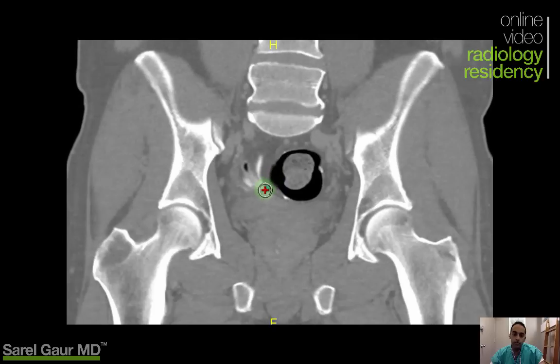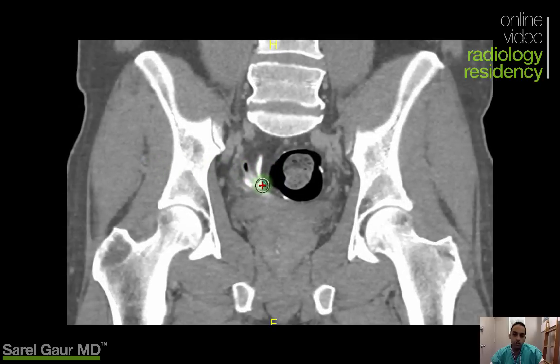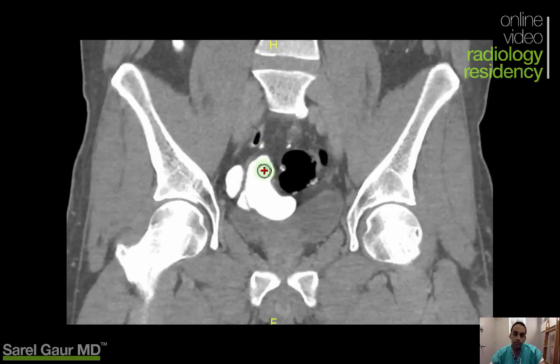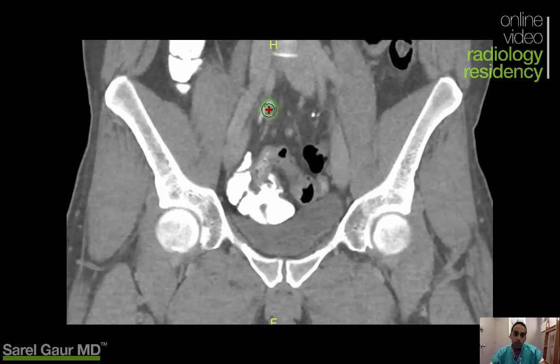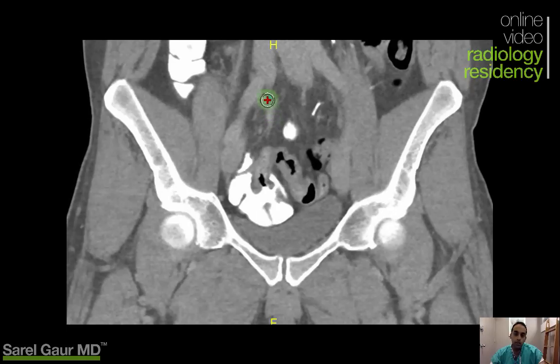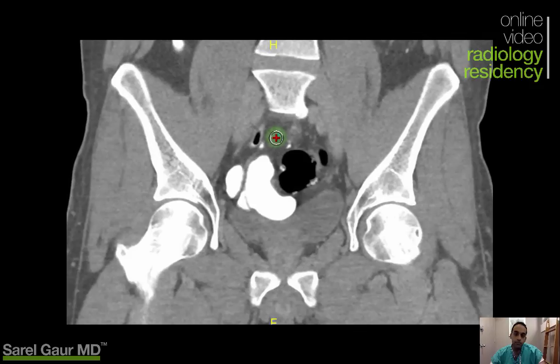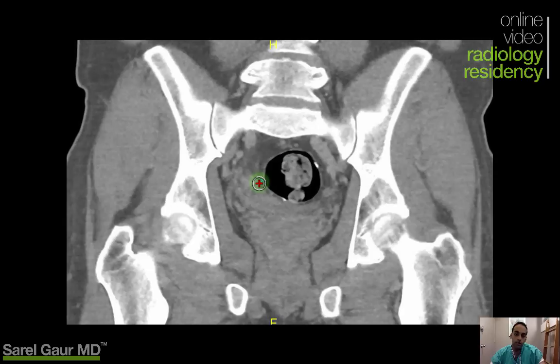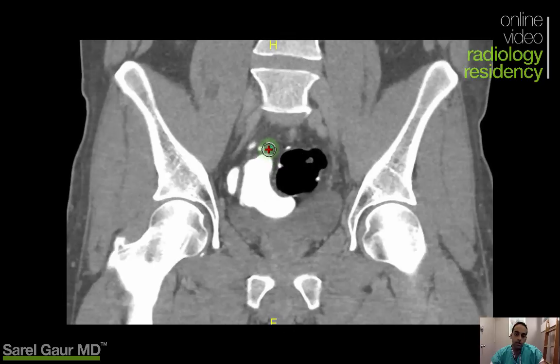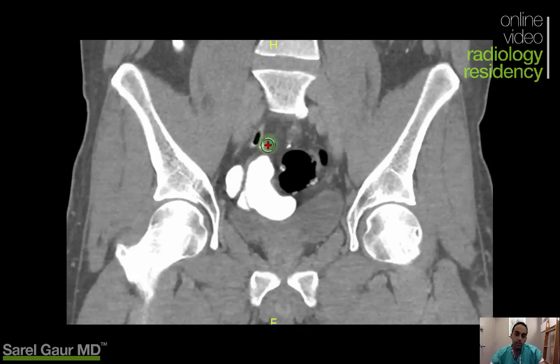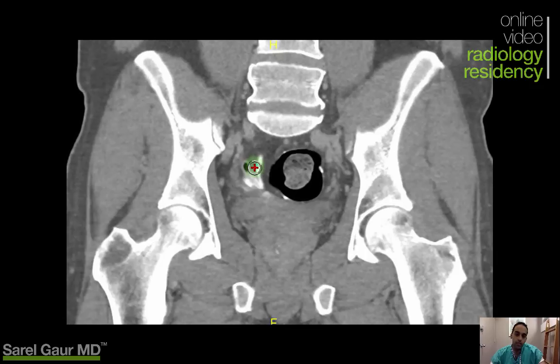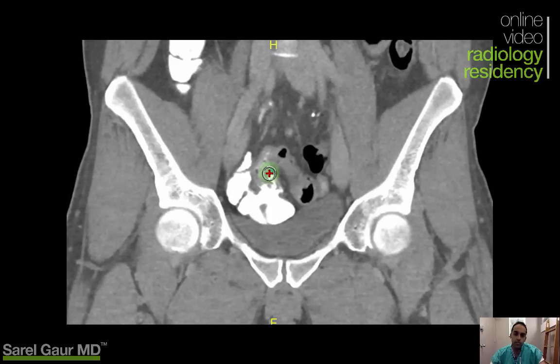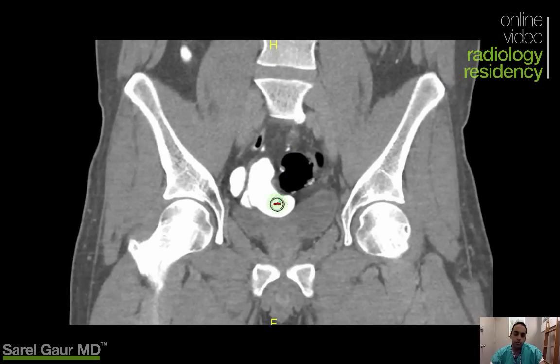Right here I'm seeing a tubular structure extending — a thin tubular structure filling with contrast, tubular, extending up and curling around, coming back down. It's contrast-filled and air-filled — you can see air within it. This is a normal appendix, so there's no evidence for appendicitis.